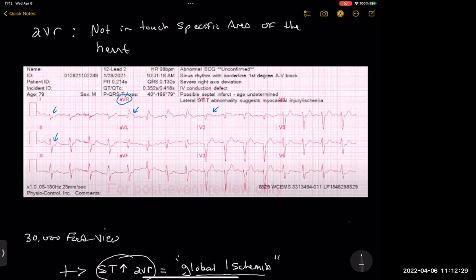And so you can see that AVR can provide some powerful information in some of these situations. There are other things that AVR can do, but this is the main one. So I just wanted to talk about AVR real quick, give it a little bit of love.